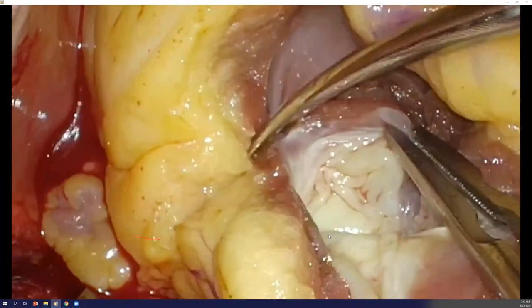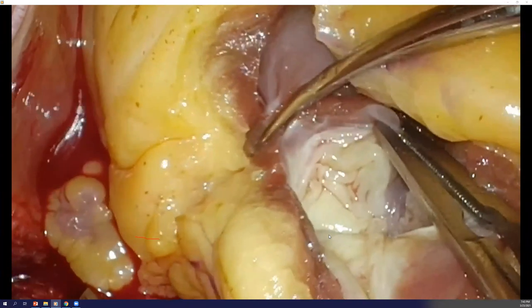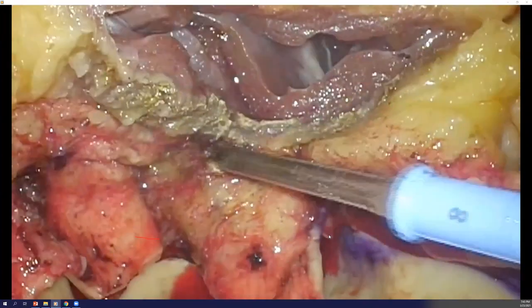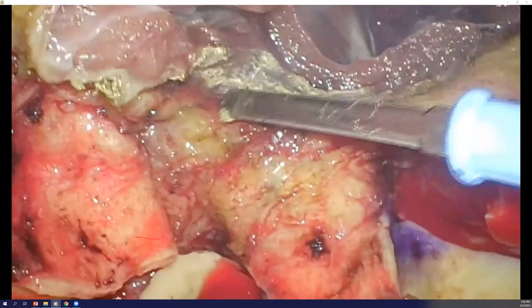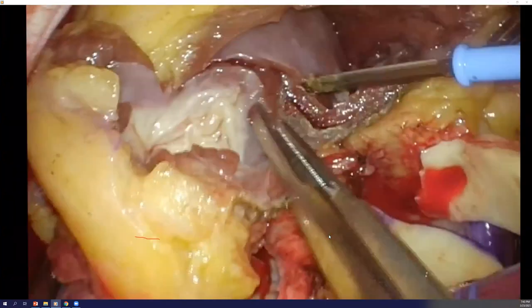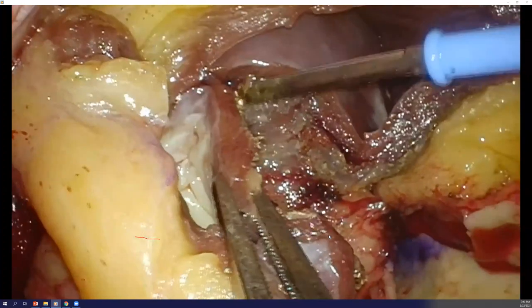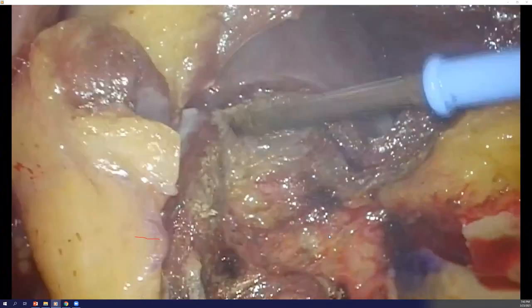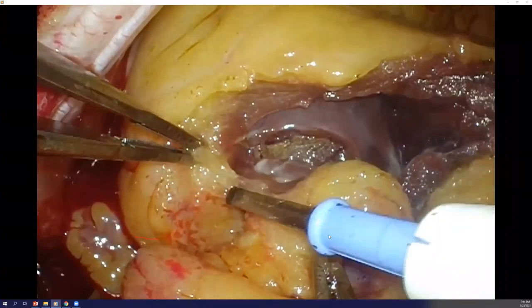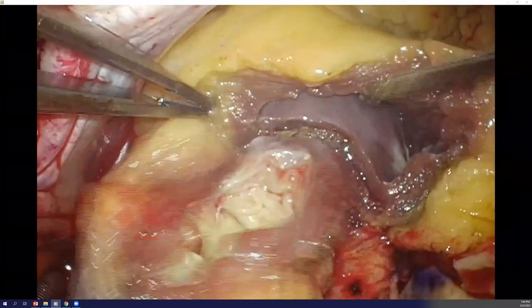And then with low grade cautery, you just lift the entire thing off the base of the heart. This video is running at 1-point-something speed, so this is not how fast we usually use the cautery. You have to just take your time to do this operation. This is the area where the first septal may cross. You have to stay superficial. Take your time, keep flipping the PA back and forth, and then eventually it just comes undone.